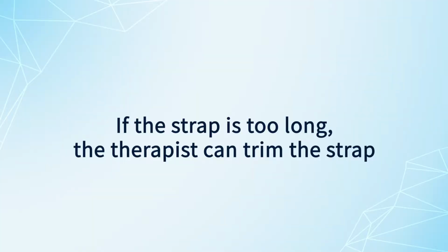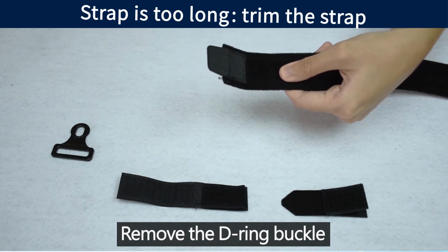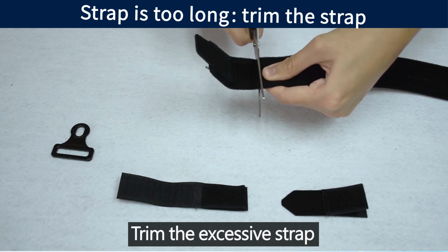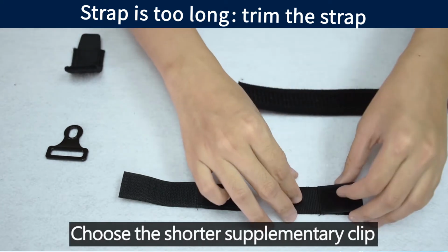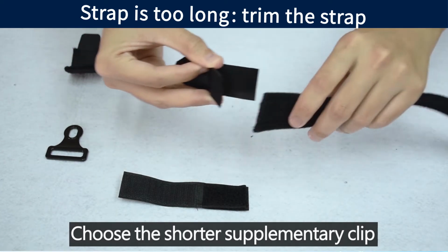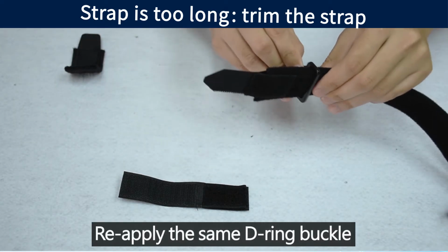If the strap is too long, the therapist can trim the strap. First, remove the D-ring buckle. Trim the excessive strap. Choose the shorter supplementary clip. Clip it to the strap. Finally, reapply the same D-ring buckle.